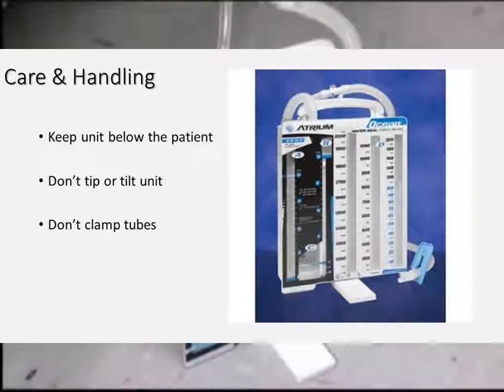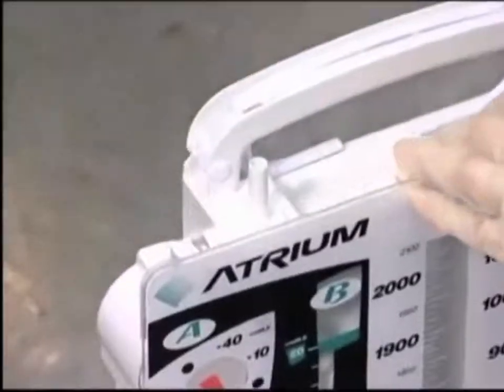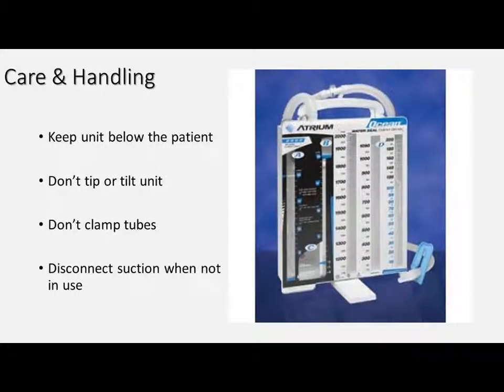For the same reason, we also don't connect the suction if we're not going to use it. So if the suction is not being prescribed and it's not actively sucking, then we leave that port free so it can vent to the air.